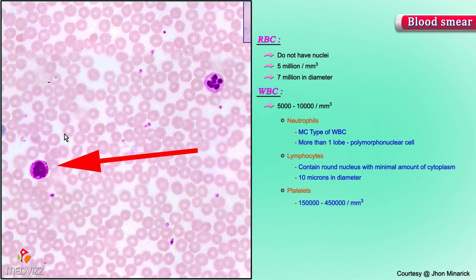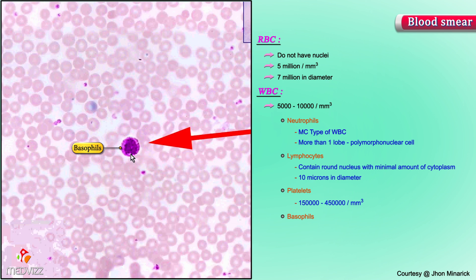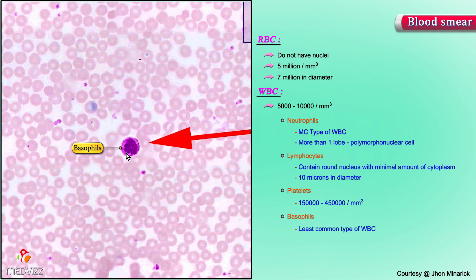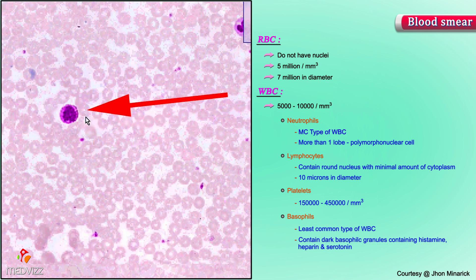At the tip of the arrow is a cell in which the granules are so dark they obscure the nucleus occasionally. These are called basophils, and basophils are the least common type of white blood cell. They contain these dark basophilic granules, which contain histamine, heparin, and serotonin.